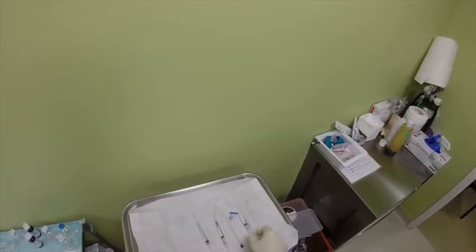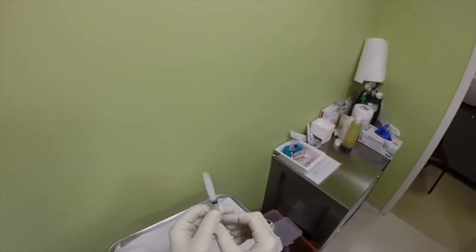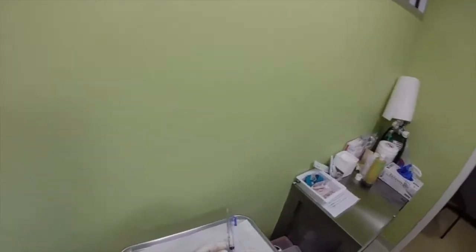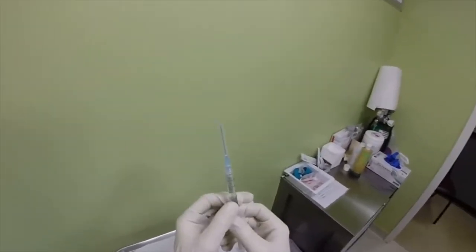This is my setup. I'm going to use Kenalog — I use 40mg with normal saline. This is my contrast. And this is local anesthetic.